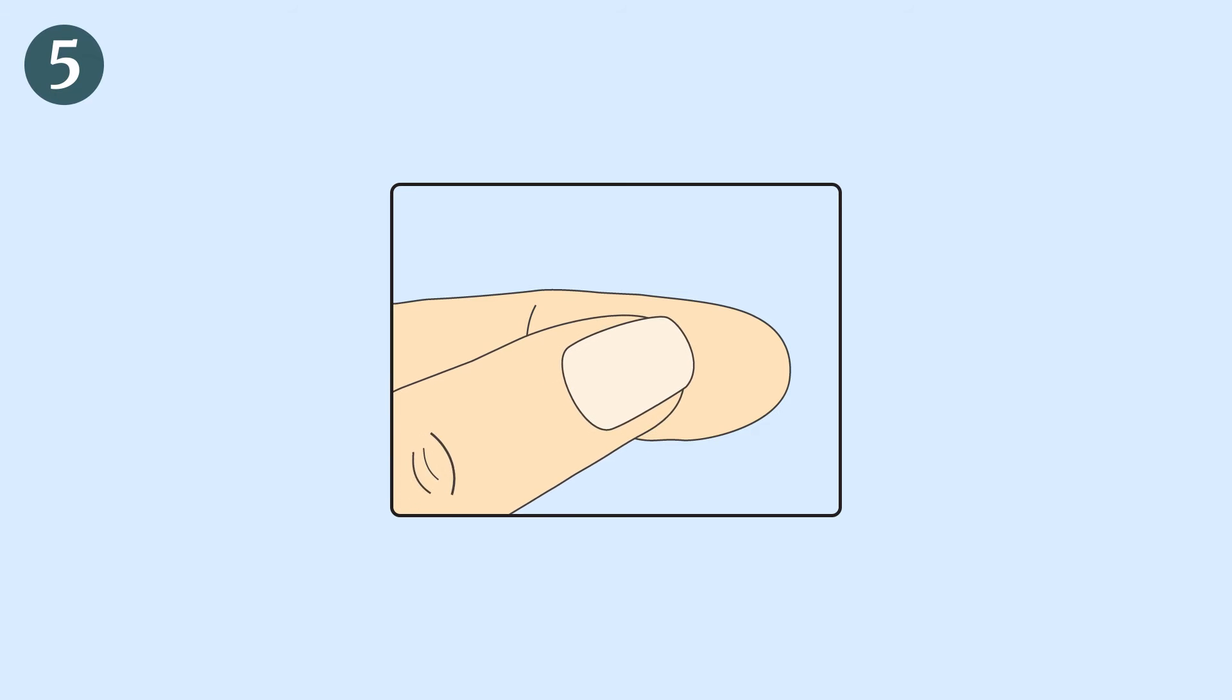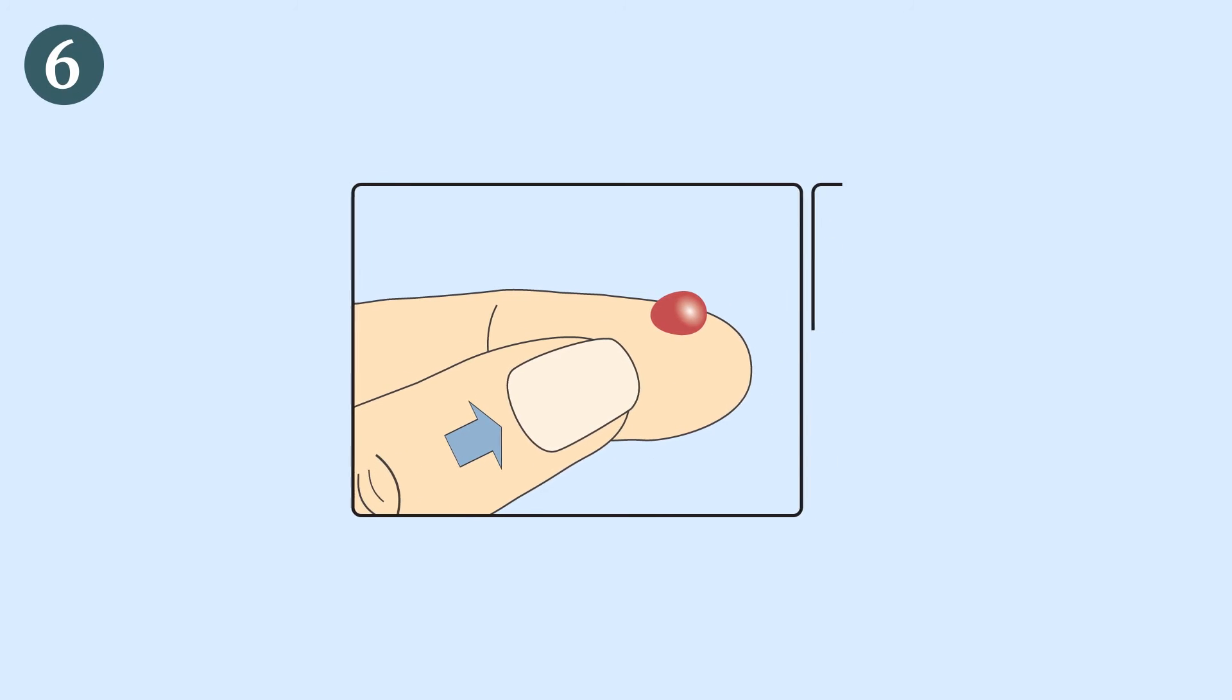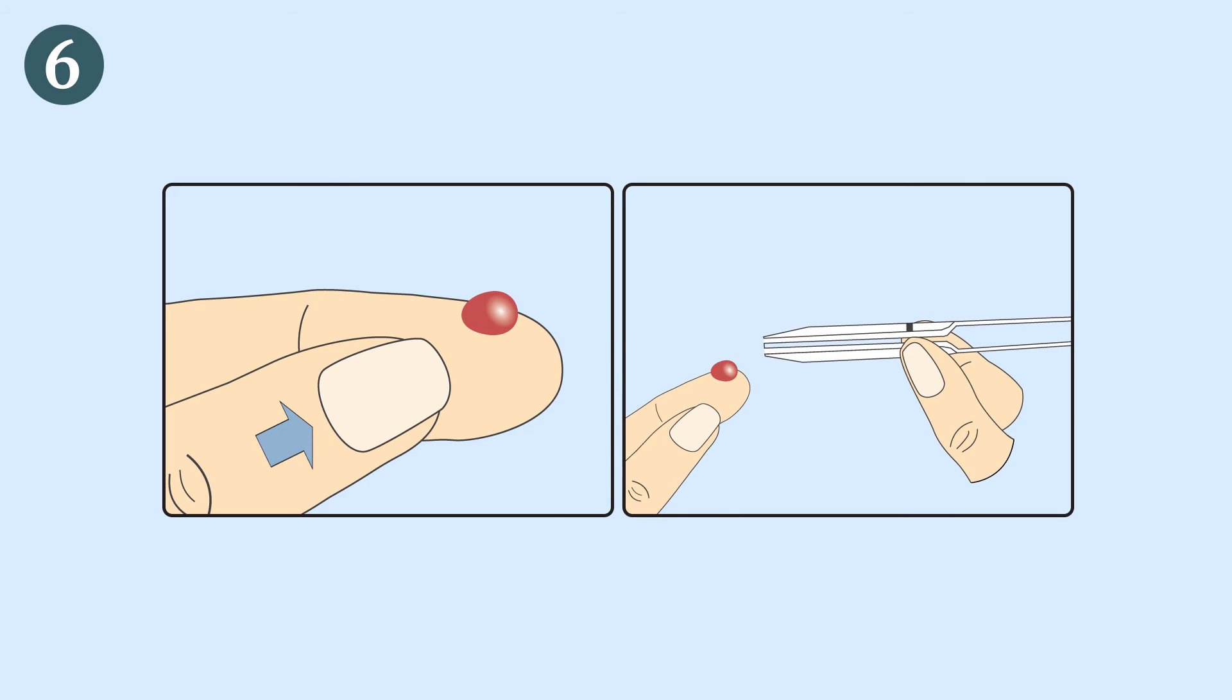Rub the finger to obtain enough whole blood sample. Without pressing the bulb, put the plastic pipette in contact with the blood sample. The blood migrates into the pipette through capillarity to the line on the pipette. You may rub your finger again to obtain more blood sample if the line is not reached.